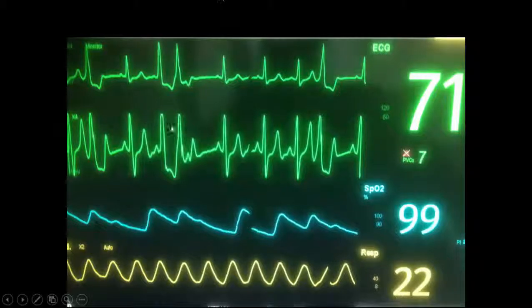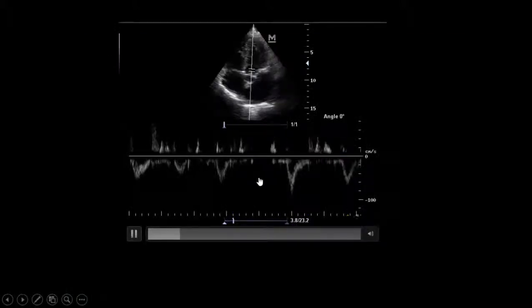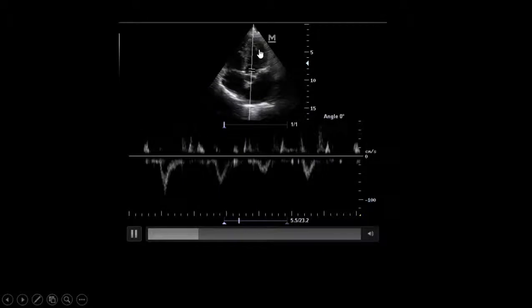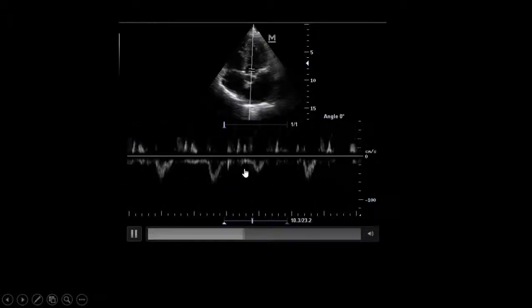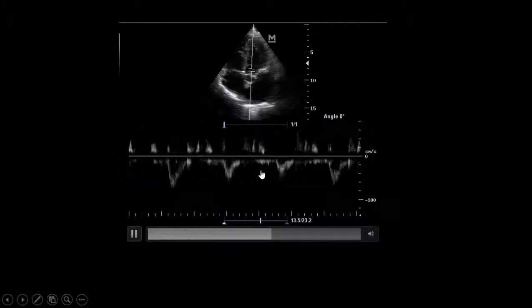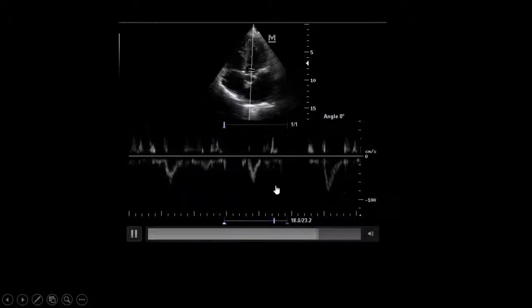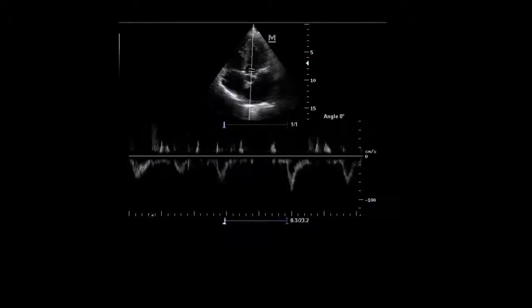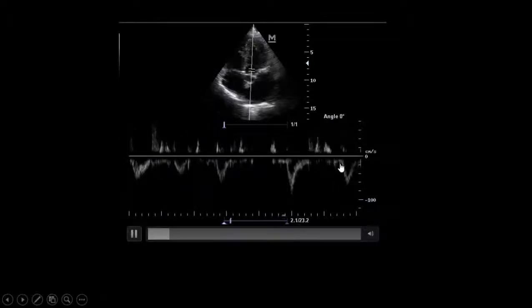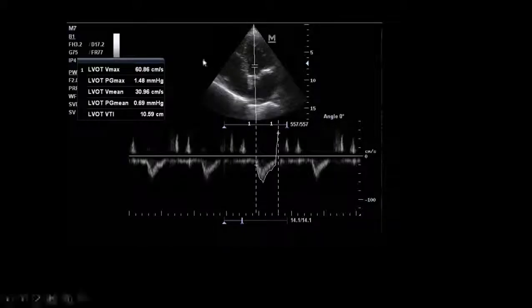Unfortunately, the patient has multiple premature ventricular beats during examination. Because of this, the VTI is not conclusive — we see fluctuating VTI due to arrhythmia and multiple premature beats. We need to wait until the arrhythmia is controlled and repeat the examination.